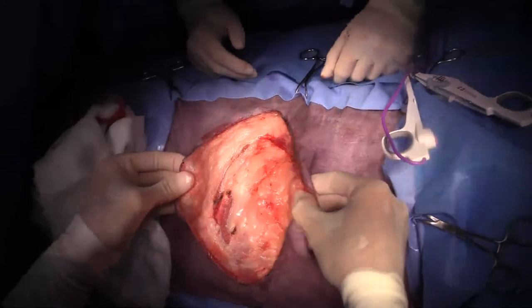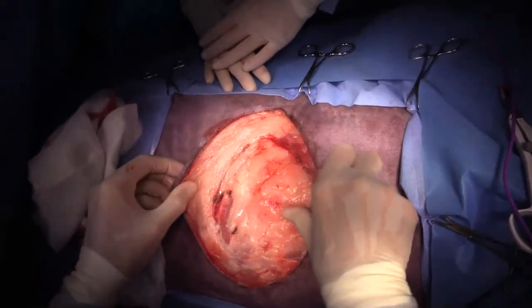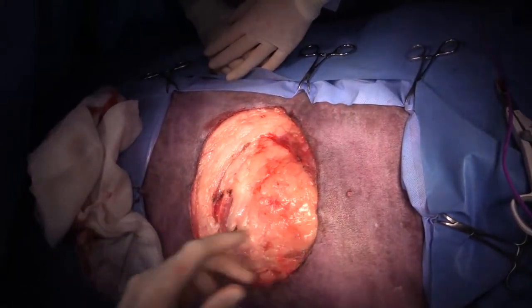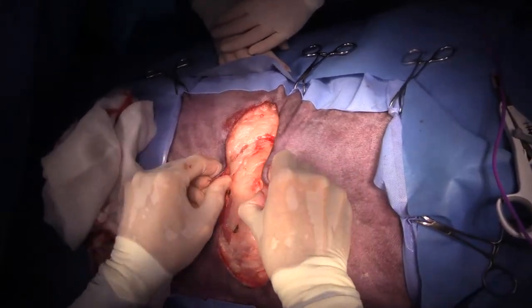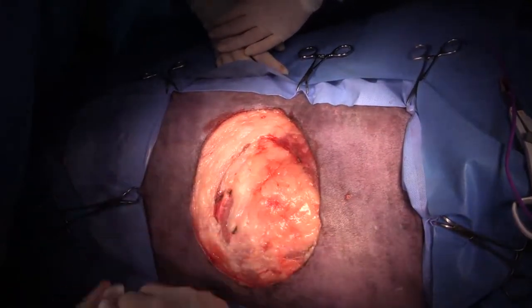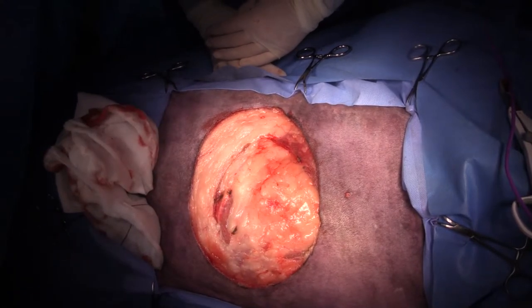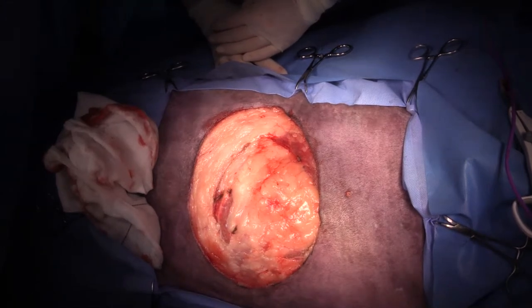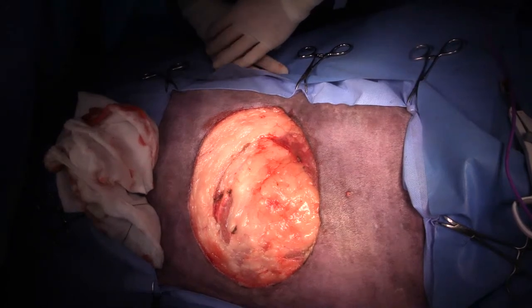So skin is viscoelastic, which means that the tension that you get is dependent upon the rate of tension that you put on it. And so we are going to put some pre-tension on it in hopes of relaxing that skin a little bit. So I'm just going to get some towel clamps, waiting for those to come.